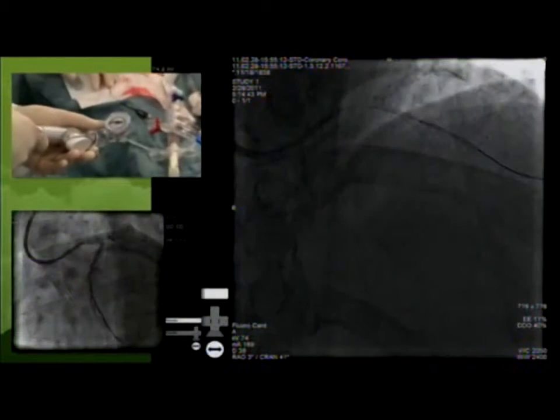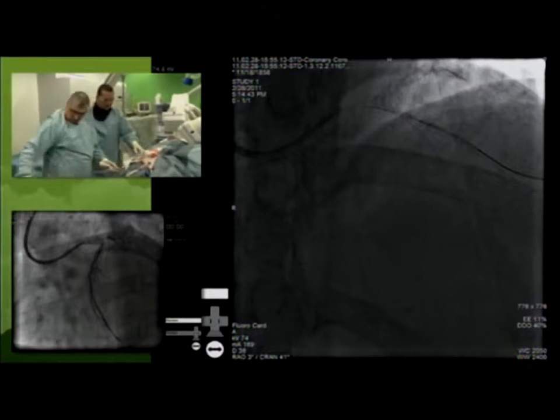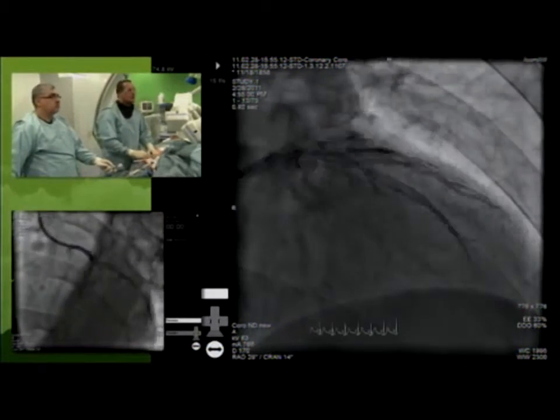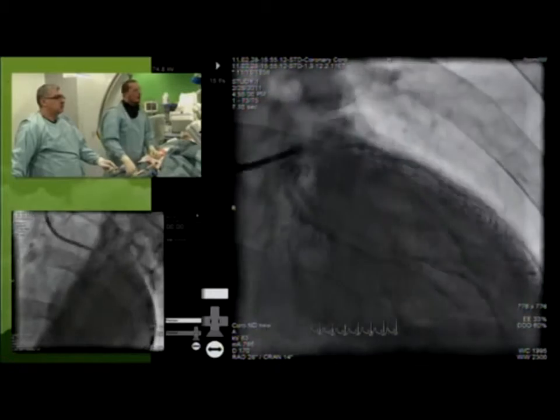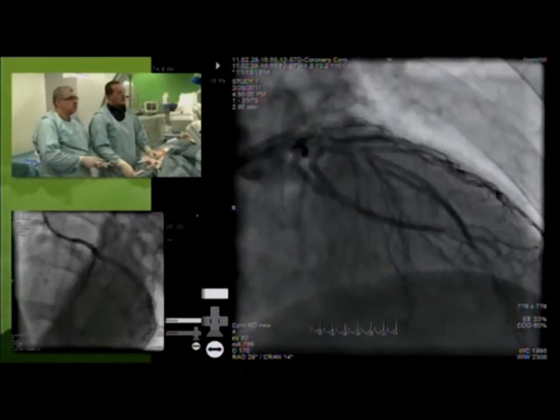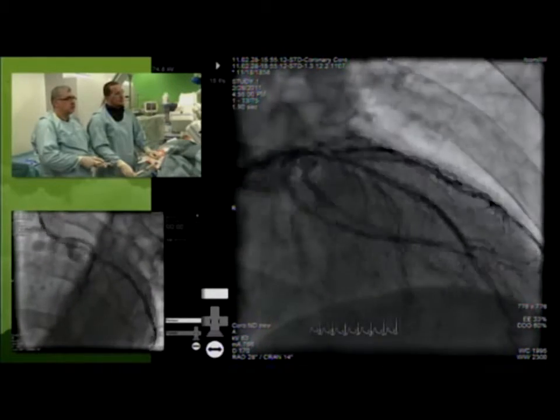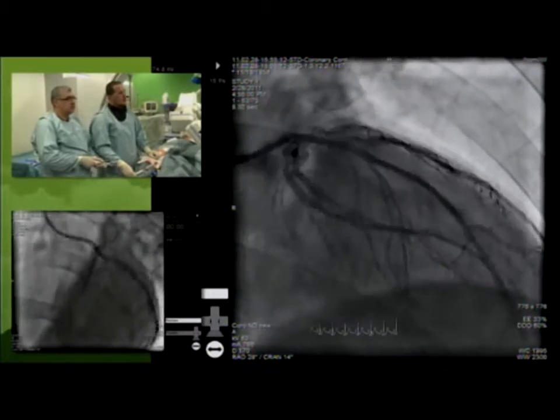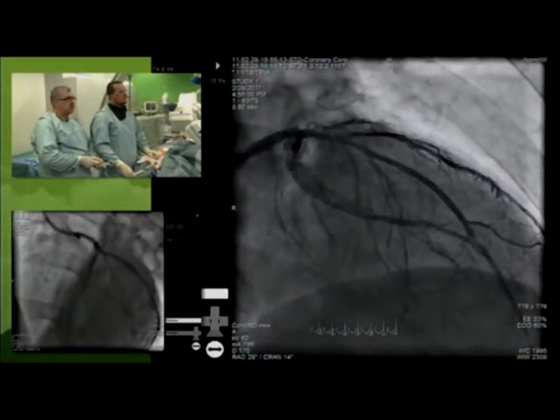Yeah. So can we look? Do you have some setup shots of your bifurcation? I mean, you called it a 111. You might be able to argue that it's a 001. And there's a little bit of stenosis, it looks like here, just after the bifurcation, which is about a 30% angiographic stenosis. Yeah. But most of the disease is obviously in the bifurcation.